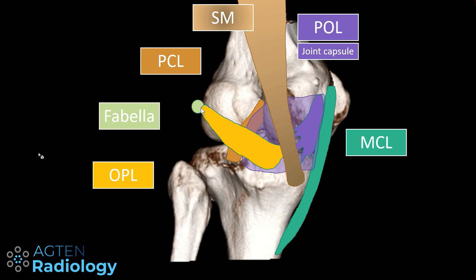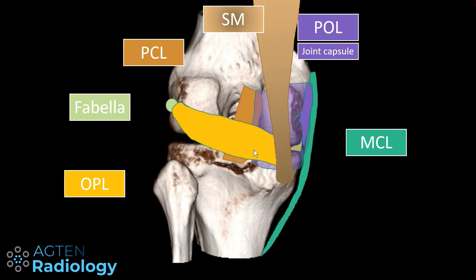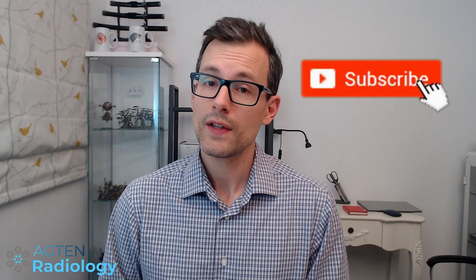It's very thin and sometimes not really visible on MRI. Here in the posterior view, we again have the MCL, the PCL, and everything in between is the posterior medial corner: the semimembranosus tendon, the joint capsule with the thickening of the posterior oblique ligament blending in, the deep layer of the MCL, the PCL, the fabella, and the oblique popliteal ligament.